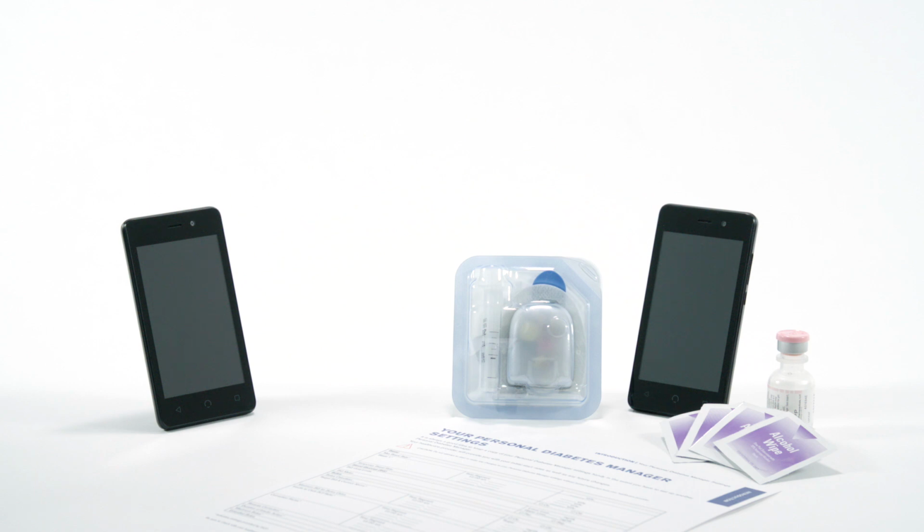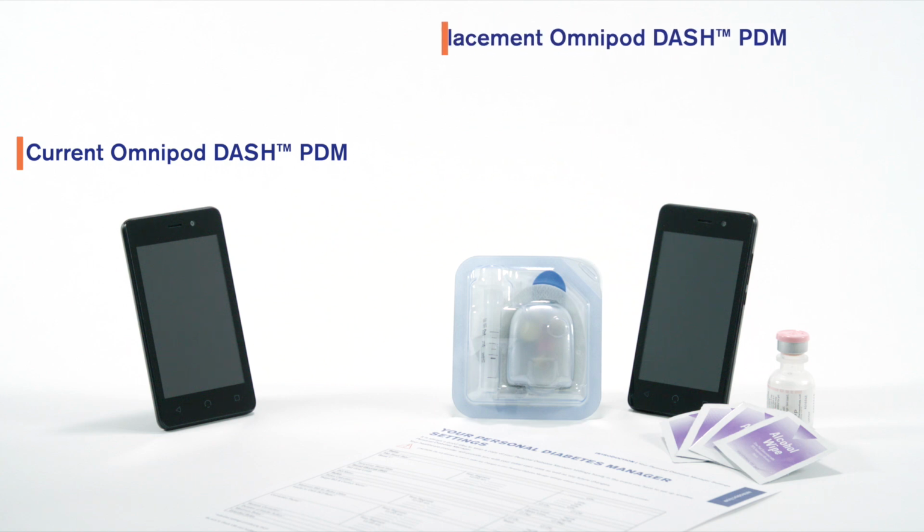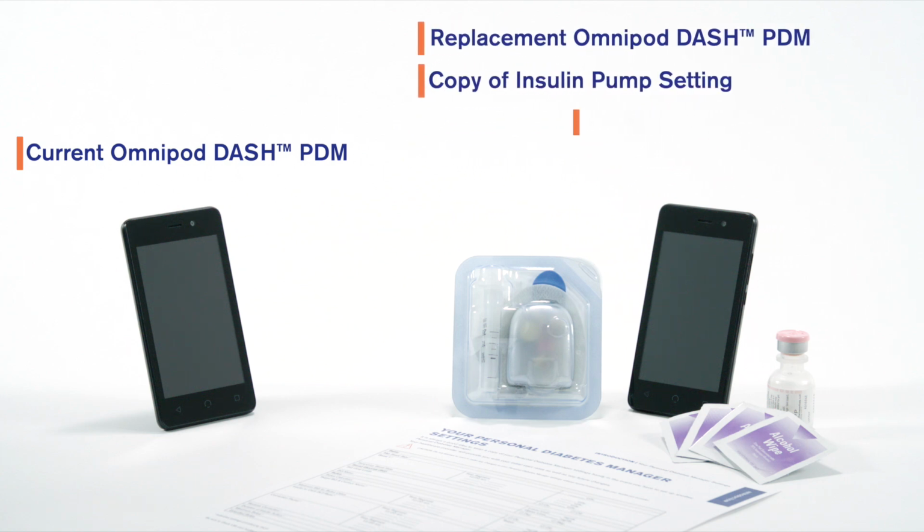Before you set up your replacement Omnipod DASH PDM, please gather the following items: your Omnipod DASH PDM currently in use, your replacement Omnipod DASH PDM, a copy of your insulin pump settings, a new pod, insulin, and alcohol swabs.